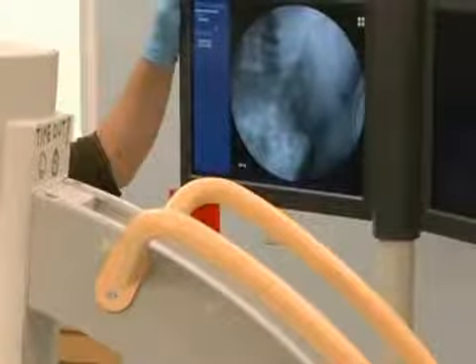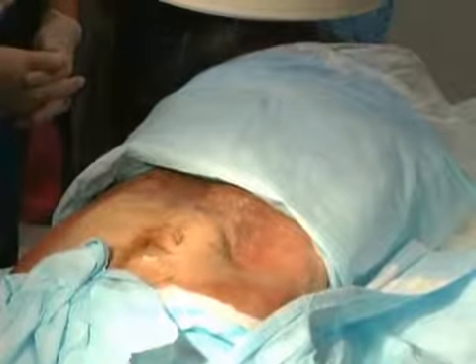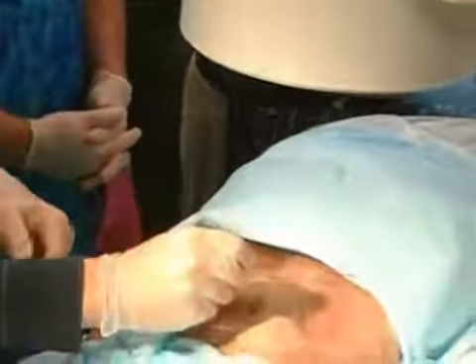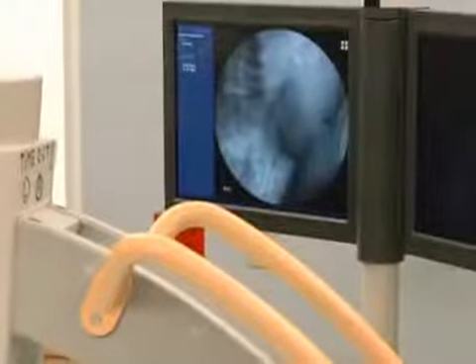So, to do the whole case, I numb up their skin, so let's find a spot here. We're going to start a little bit more lateral than that, right about there. I'm going to numb up the skin, and then I use just a 25 gauge hypodermic, and then I'll go to a 25 gauge spinal, 3.5 inch. Now I'm on bone, so I'm going to go down. Where's the base of the sacrum here? It's right there. Now I'm going to put a little bend in this, trying to numb them up. Okay, so I'm on bone. I'm running this along as much as I can to numb up the track where I'm going to go.